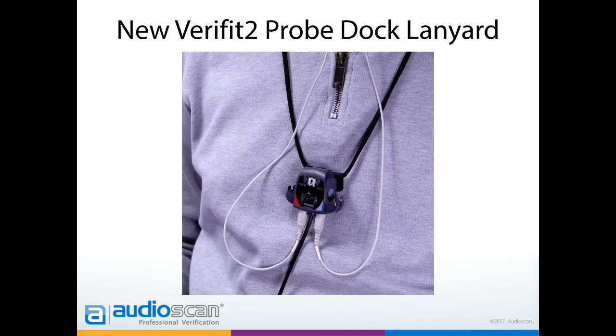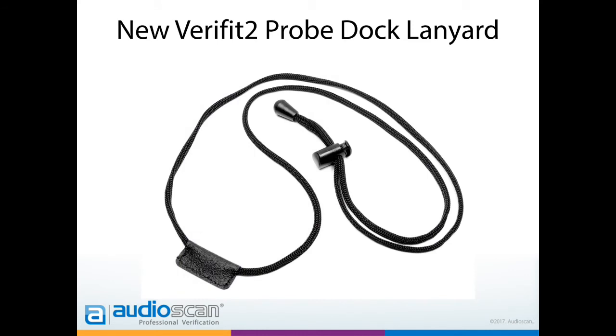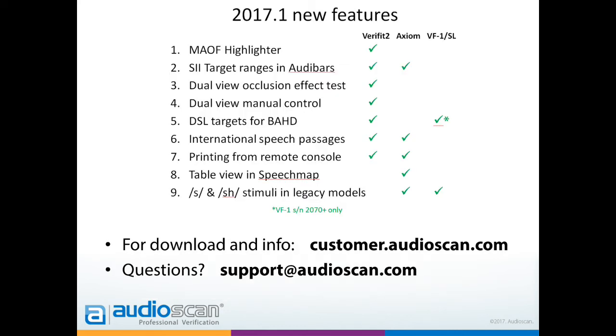A quick note for early adopters of the Verifit 2. This product now ships with a custom lanyard for the probe dock. If you have an earlier unit that didn't ship with this, just give us a call or an email at info@audioscan.com. Give us your serial number and confirm your address, and we'll send you one out.